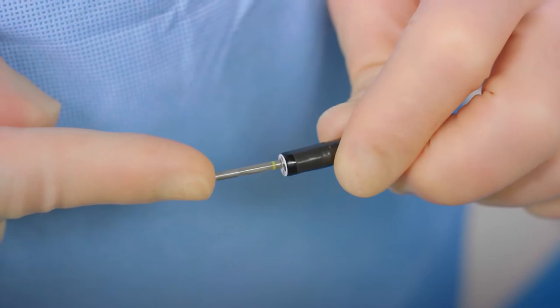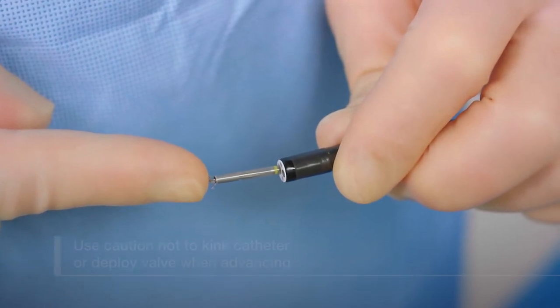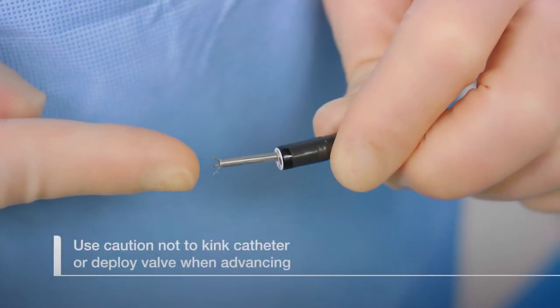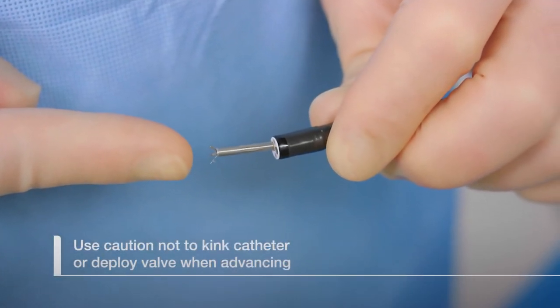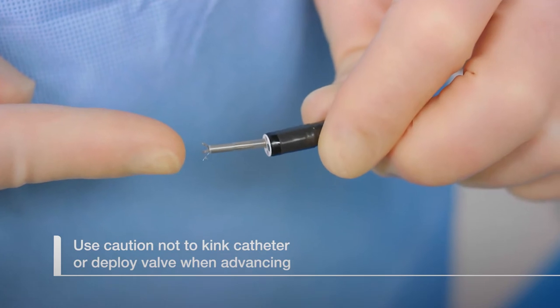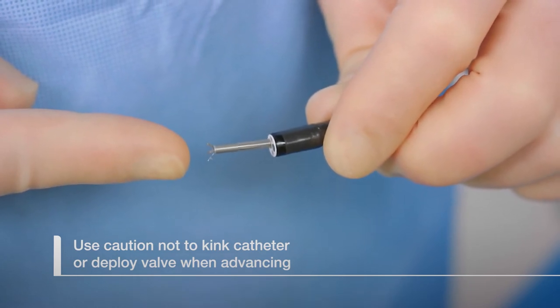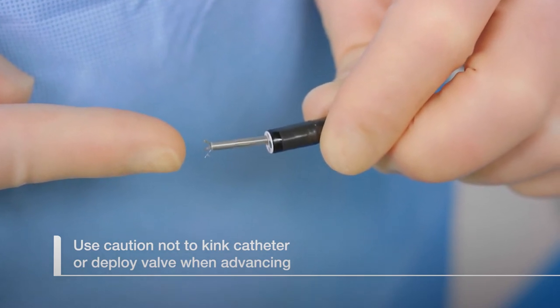While directing the catheter to the target airway site, do not apply excessive force to advance the catheter, as this could kink the catheter or result in a premature deployment.